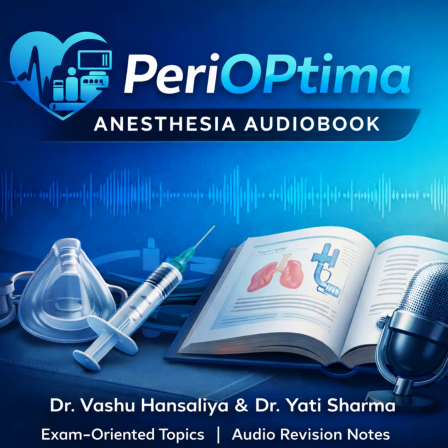Okay, let's put it all together in a real-world context. Clinical decision-making. How do we choose the right device for the patient in front of us? It's all about matching the tool to the specific task and the patient's anatomy. So, for a routine, straightforward, normal airway, DL is still the conventional standard choice for most practitioners.